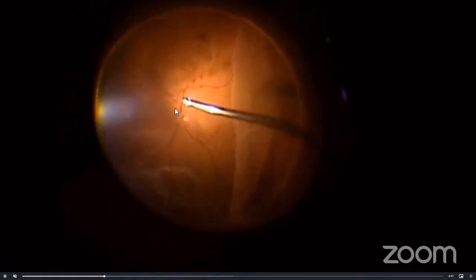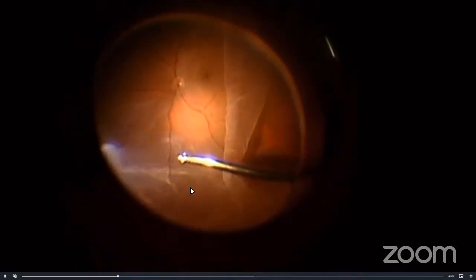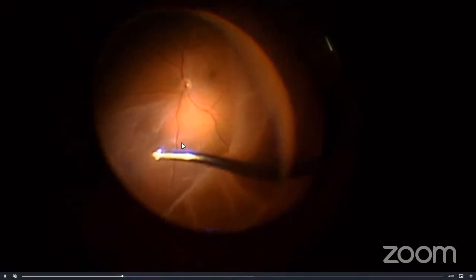Okay, in this case, you can see that this is a very folded giant retinal tear and almost a total retinal detachment here. There is also some form of vitreous hemorrhage here, in which he is trying to do the core PPV. And you can see that the retina is relatively very mobile when he proceeds with the PPV without the heavy liquid tamponade.